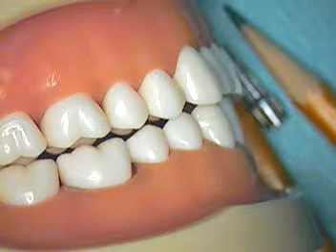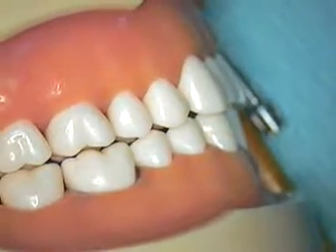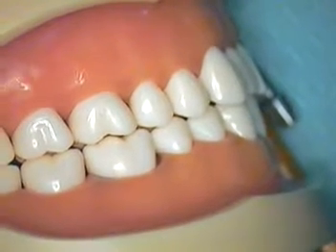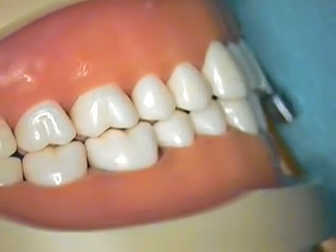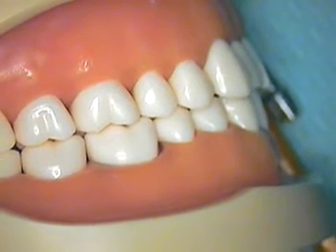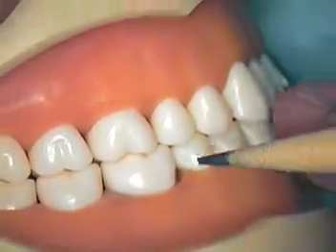Hello, this is Dr. Jerry Cuomo. I'm here with the molar crown preparation segment. This video is going to incorporate the entire tooth preparation, and to start things off, we're going to take a look at our molar as it appears in the typodont.